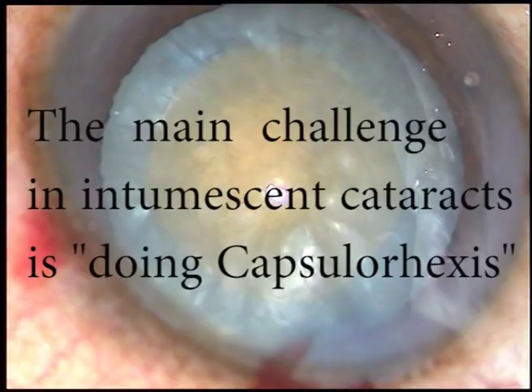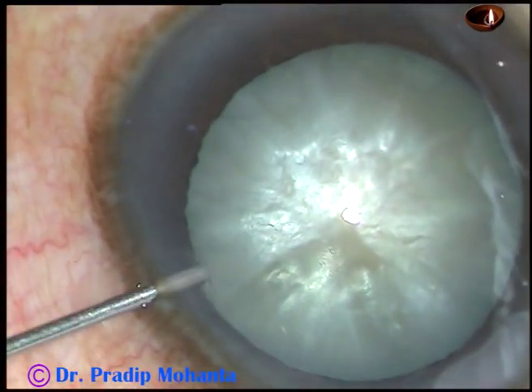Friends, what is the main challenge in intumescent cataracts? Yes, it is doing capsulorrhexis.